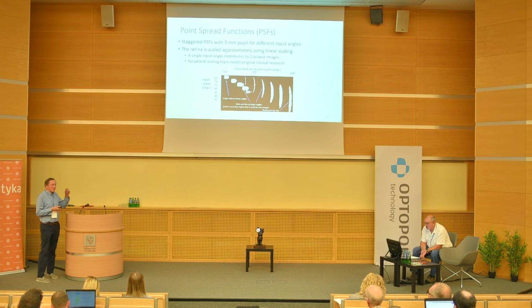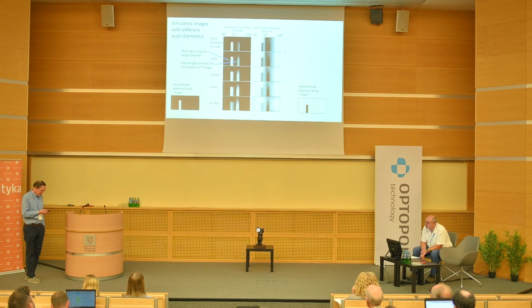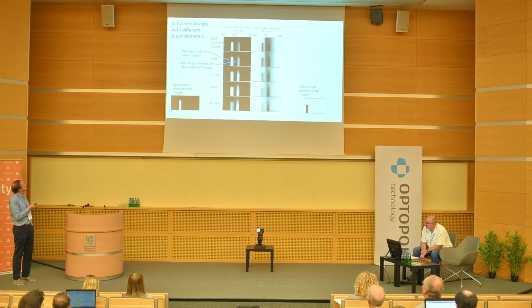It's hard to explain without you doing it. So this patient is saying, I'm putting my finger here and I'm seeing a double image. But if you go to lower angles and higher angles, you can see something else. And then there's kind of a dynamic component to it too that isn't captured in this. The images themselves are a simplistic modeling of it, if you like, with only approximate scaling, because it's really difficult to do. You start out with one finger, but you see two. On this side it's clearer. On here you also get the shadow-like component, in addition to seeing the double image.